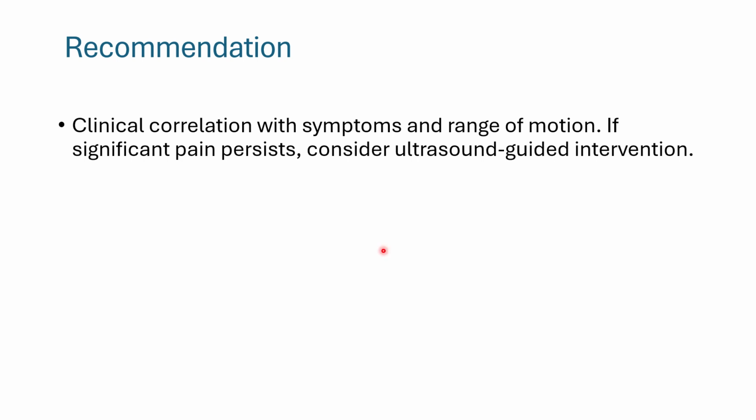The other issue is in terms of the recommendations. If you are not all that experienced, there's no need for you to give all these recommendations, but to put spices to your reports. If need be, you can also give recommendations. Clinical correlation with the symptoms and the range of motion is advised. If significant pain persists, consider ultrasound guided intervention. This is a sample report on a case of supraspinatus insertional calcific tendinitis.